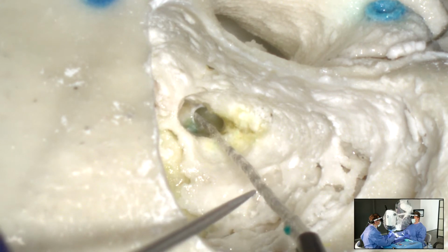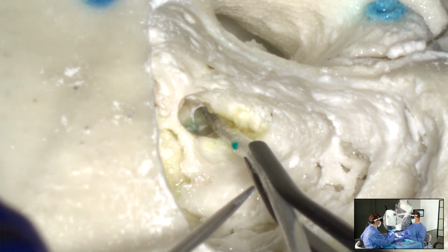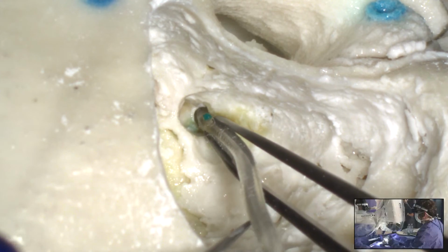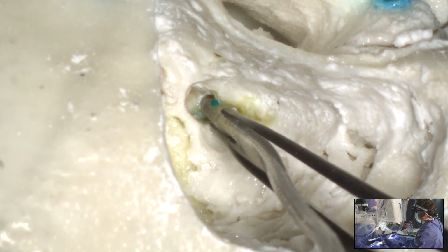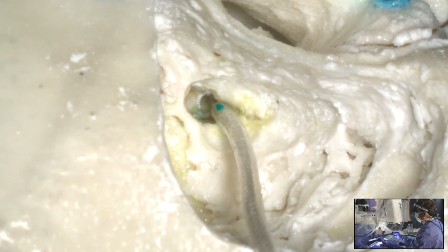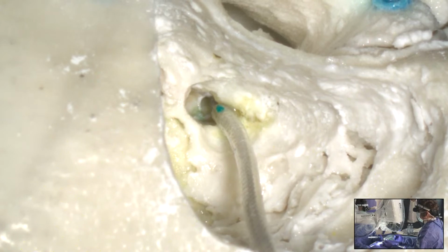And now the part is going on here to get this electrode nicely and straight into the cochlea, and this is a little bit quick maybe, but this is how to get it in. Okay, so I hope you have a perfect view like me on my display, and very precise, very sharp, and I'm in a very comfortable position, can move my head and don't lose the picture of the surgical field. Can you also show us a bit of the inside of this anatomy, like zooming in and orbiting a bit around?